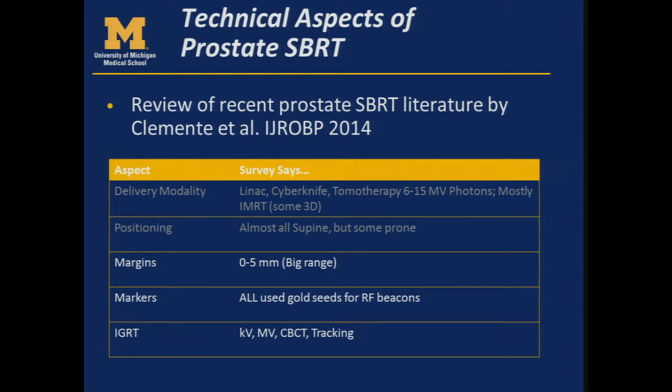Okay, so there was this really great review paper that was in the Red Journal last year that reviewed a bunch of recent prostate SBRT literature. And so I really just wanted to give you the summary from that paper, which I thought did a really nice job summarizing what's available right now. So they looked at a survey of different aspects of treatment, so delivery modalities, positioning, margins, use of markers, and use of IGRT for prostate SBRT trials in the literature.